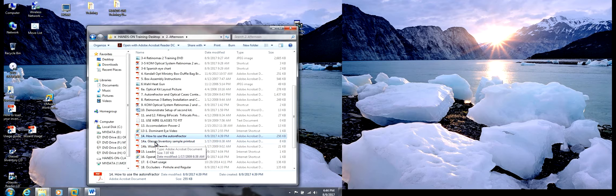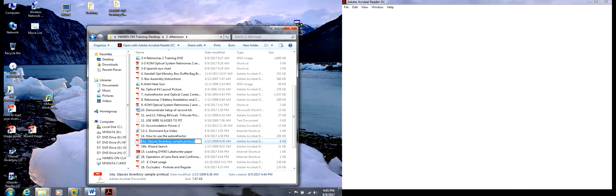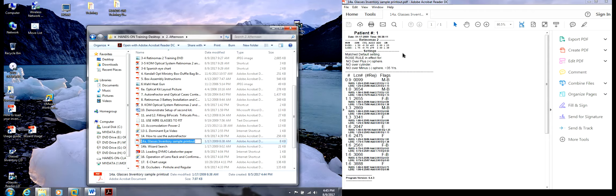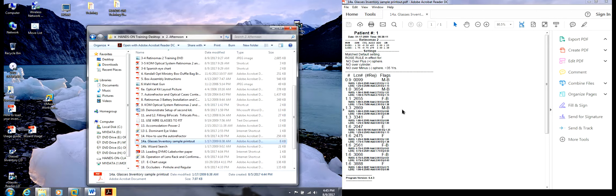Now, whenever you're printing out, this is a sample inventory printout from the autorefractor. You will see this.